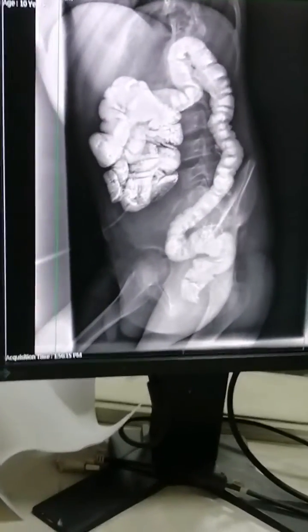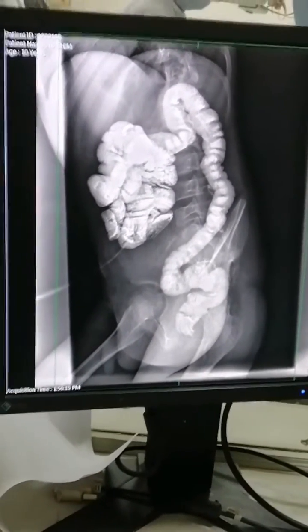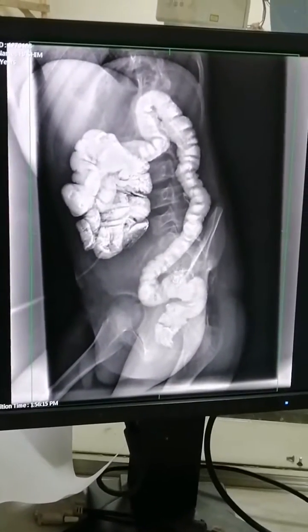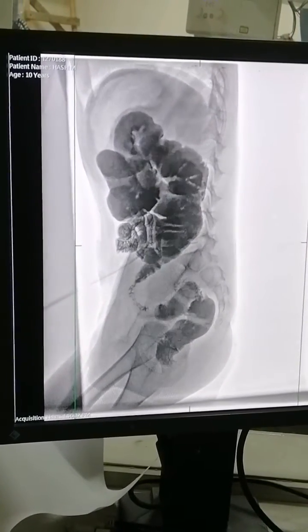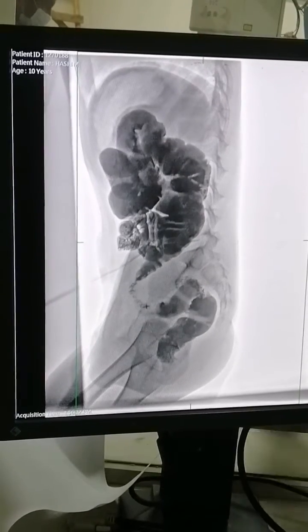Here in the fluoroscopic view, you can see it is totally intact — the water-soluble contrast has passed completely to the rectum. There is no deformity and no missing of the soluble contrast.